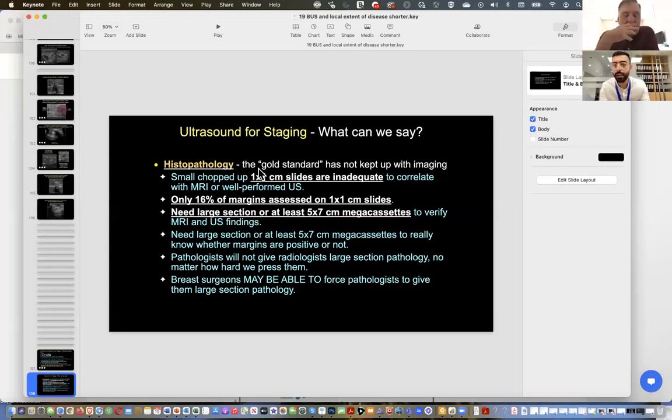Doctor, we have a question from Ibrahim. It says, if we face a patient with clear margin lumpectomy, invasive cancer, then after 1 month has an axillary suspicious non-palpable lymph node, but seen only at ultrasound, what's the next step and what BI-RADS is given? It's in the chat if you want to see it. So are you saying that you've ultrasounded the lumpectomy site and that it was clean, but you just have an enlarged lymph node only on ultrasound? Was that the question? Sahar Ibrahim, can you elaborate, please?